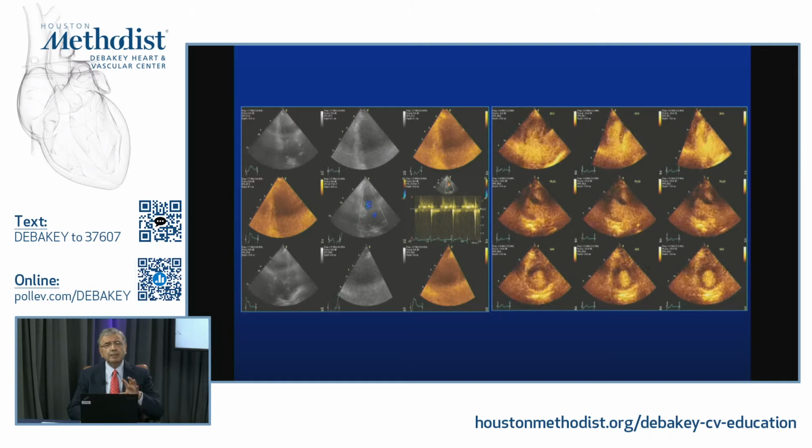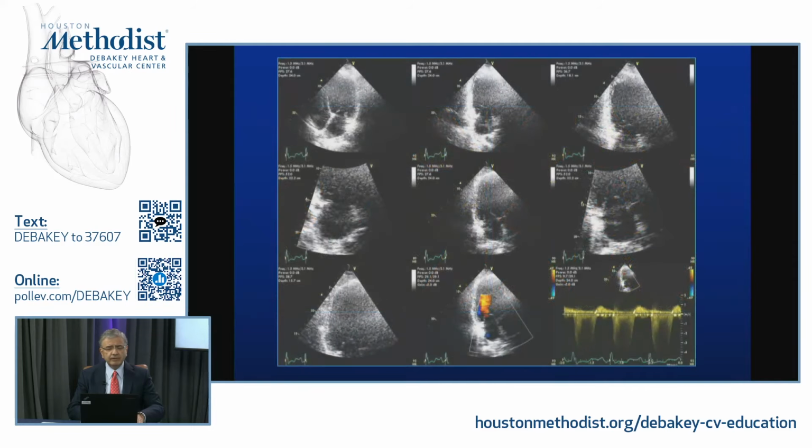And therefore, appropriate use of contrast echo should be part of every laboratory. The good thing is that IAC, the accreditation body, has mandated that laboratories have protocols for how to have contrast in their laboratories, and all the processes that are needed. So I think this is really very important.